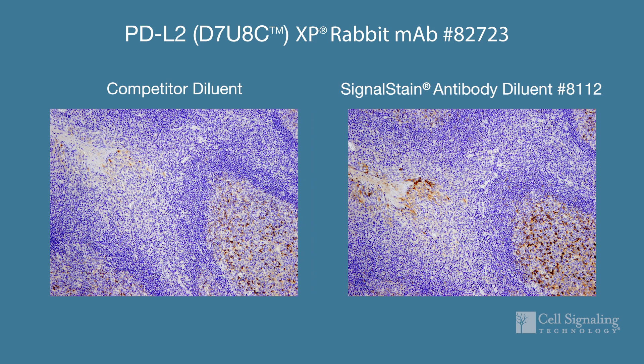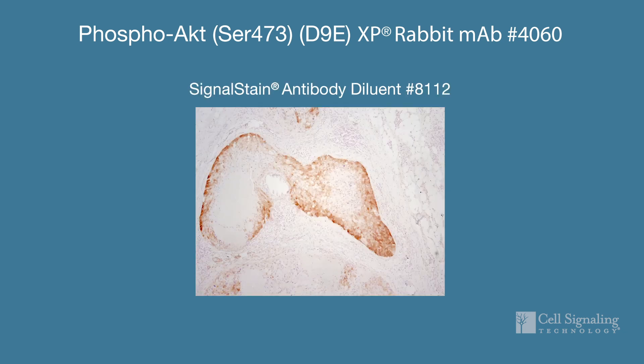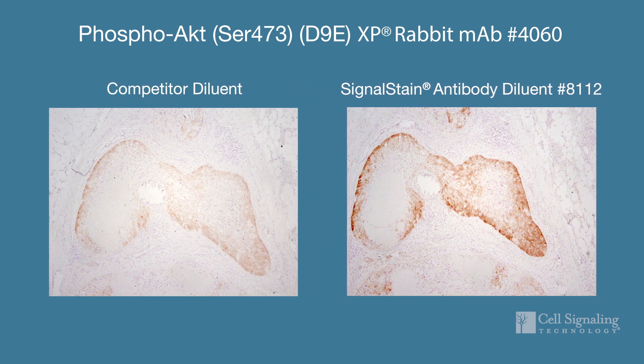The optimal antibody diluent supports antibody-epitope interactions and specificity, and ultimately the strength of your staining. Differences in diluent pH and ionic strength can increase or decrease specific interactions of the antibody with its target. Additionally, diluent properties may affect non-specific interactions with off-target molecules and can affect antibody stability. These problems can be overcome by addition of serum proteins as stabilizing agents, along with optimizing the pH.